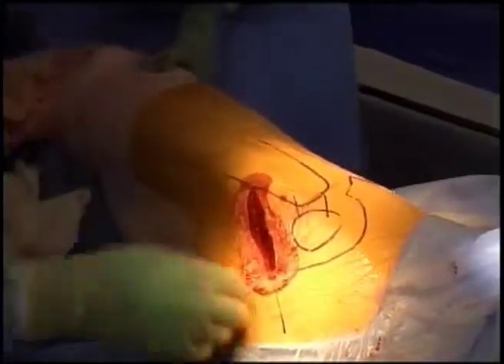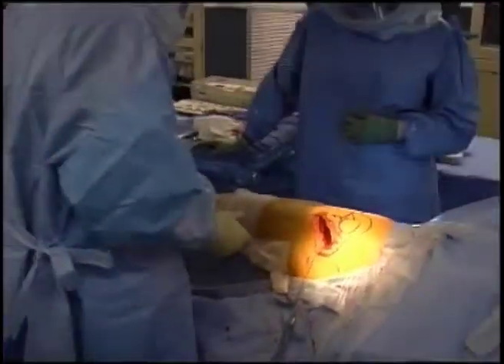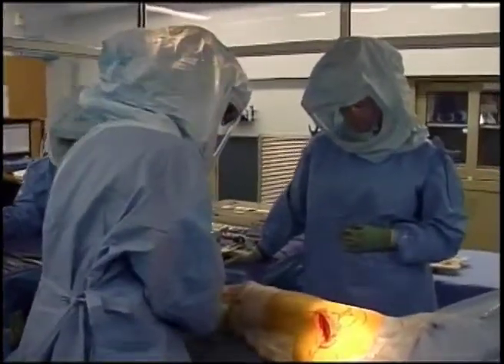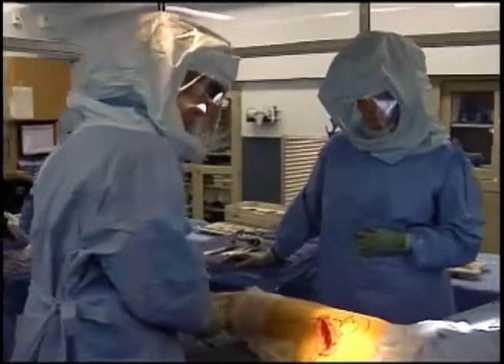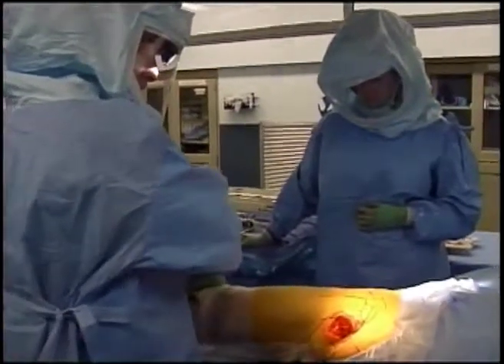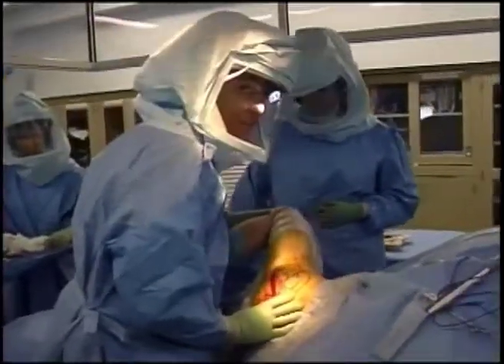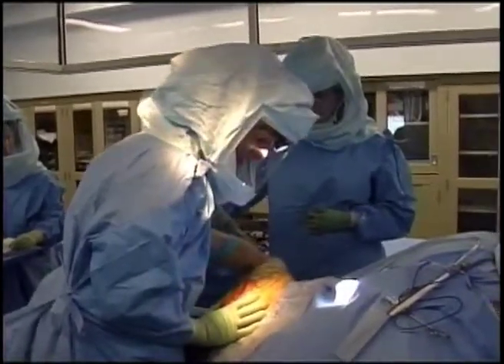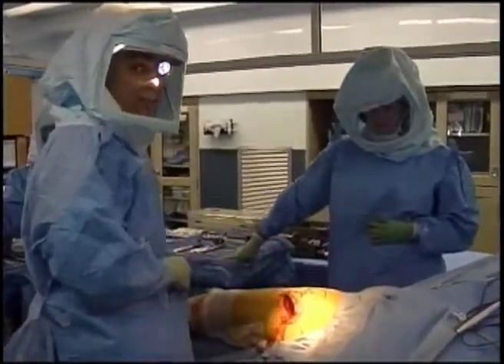The hip is popped back into place. We then check a couple of things: first, the patient's leg length, by feeling the position of the patient's knee relative to the opposite knee on the table — the legs are now about the same length. We also check stability: I twist the patient's hip out to try to pop the replacement out the front, and it's stable and won't dislocate. I then bend the hip up as if sitting in a chair, turn the hip out, and confirm the replacement doesn't pop out the back — excellent range of motion and stability.